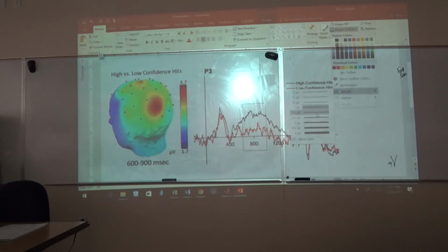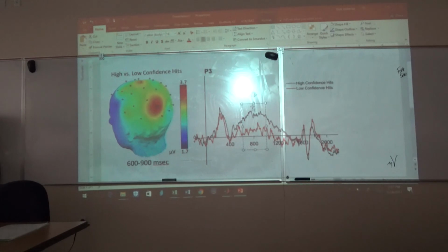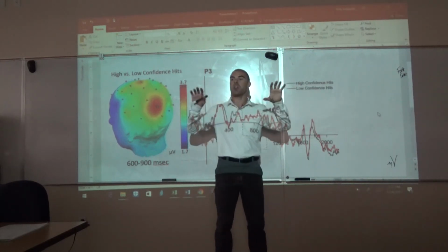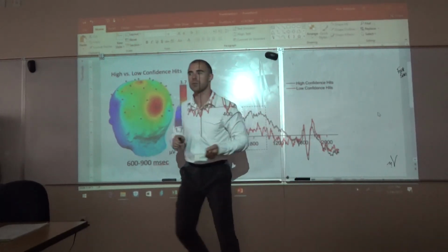You guys can tell me what you think. We'll go dashes. I like the fourth one down. And for me, that makes things nice. What do you guys think? Does it look a little nicer? Right? These are really cool figures to be proud of, right? I think, at least. For all the hard work you guys are doing? Okay. Now, one thing I like to do, actually, too, I mean, sometimes I'll even erase this, too, or put a white box over it and just type it in even bigger text to make it more clear. But I'll leave that up to you.